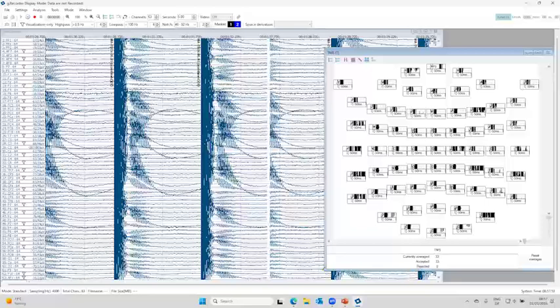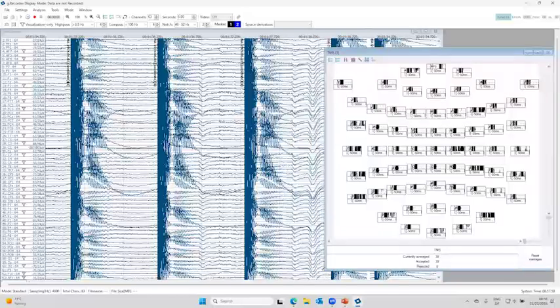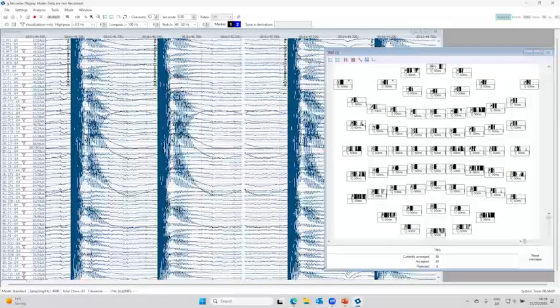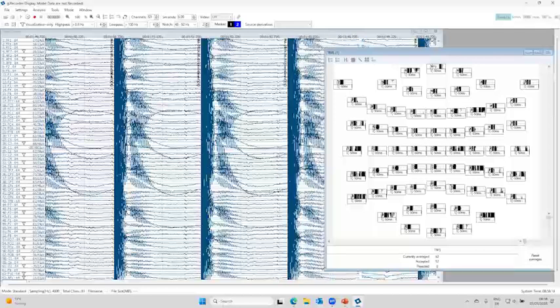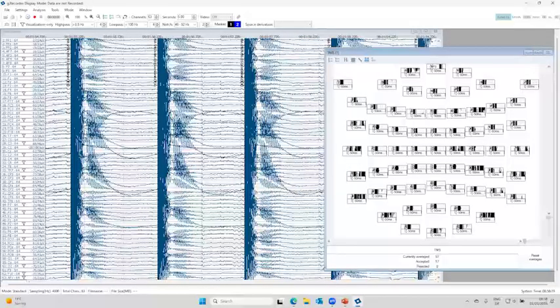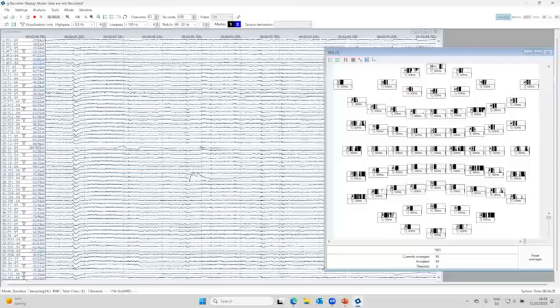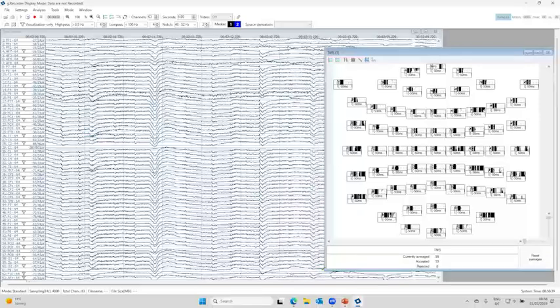Okay, so we already have around 40 trials. That means that in less than 20 minutes, we actually perform the experiment. As a comparison, a 10-10 preparation of 64 channels with passive electrodes, just the preparation, would take 40 minutes for an experienced researcher. Okay, so we won't bother Christoph much more. We will take off the coil, and I will pass to another screen.